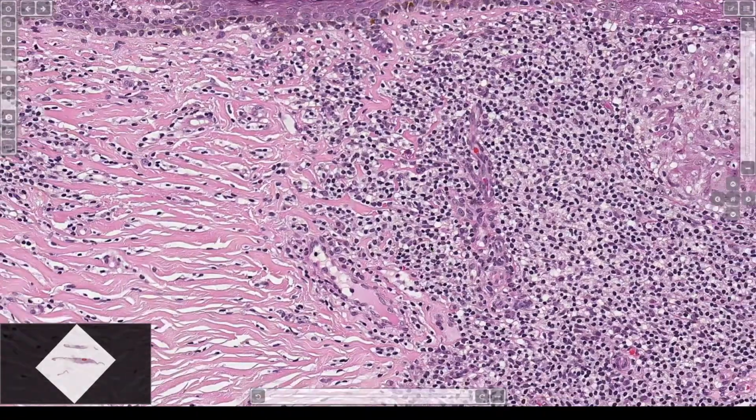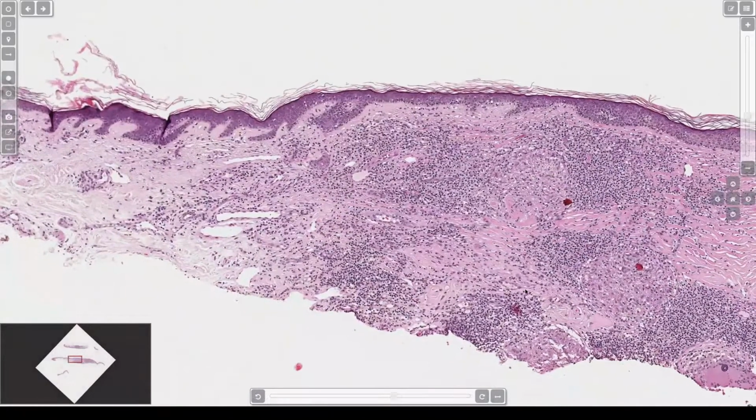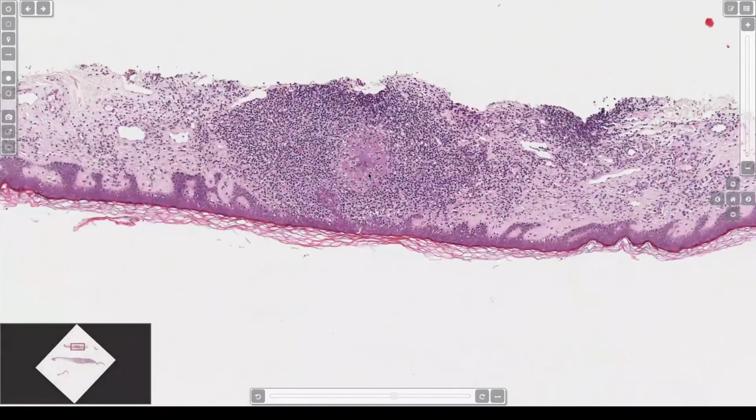Sometimes they're broken down. And of course, with a lot of these fungal infections, where you are geographically matters a great deal, right? If you're in the American Southwest, cocci is really common. We never see cocci where I live in Arkansas. We see histo all the time. You can see blasto sometimes. So there's certain things that are very different geographically depending on your kind of environment and whether or not the fungus likes to live there. So that's Coccidioides, Coccidioidomycosis.